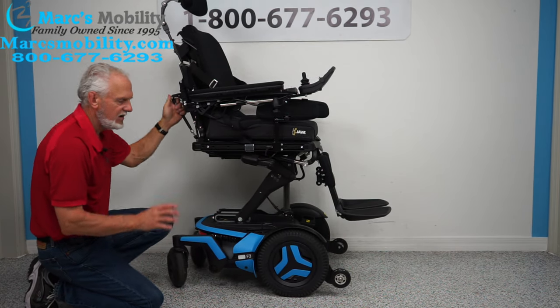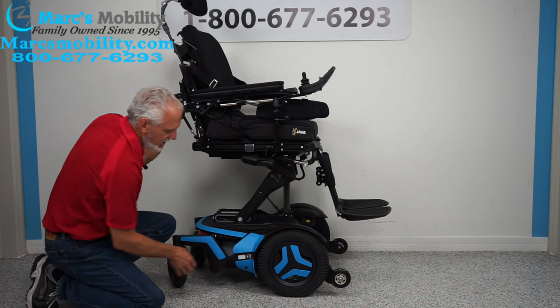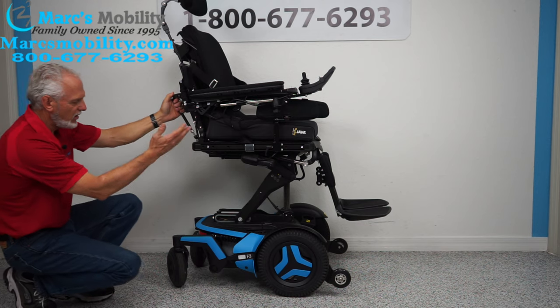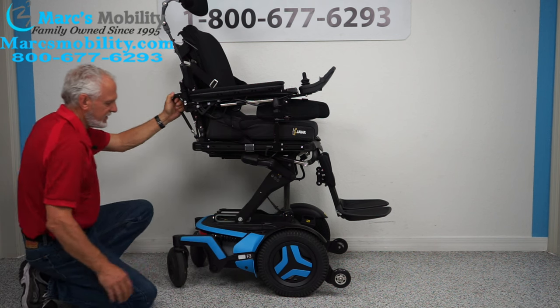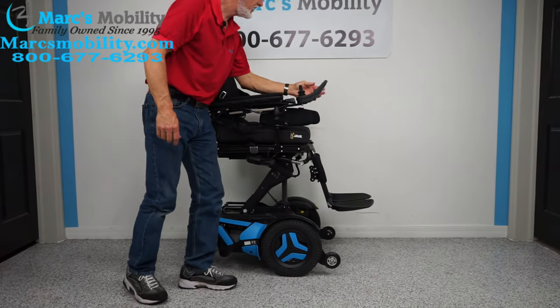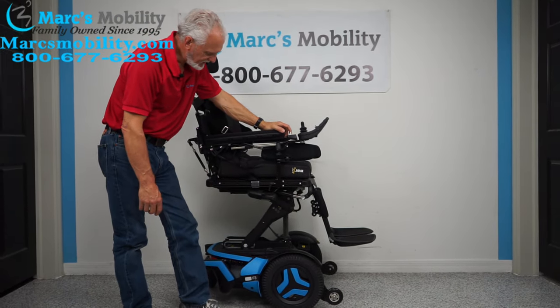Very easy. When you're done and you have it in neutral, don't forget to put it back in gear and then you can turn your power back on. You can see the armature here for the seat lift. The actuator is actually right here for the seat lift. You can see how nice and clean it is — just a very nice power chair.